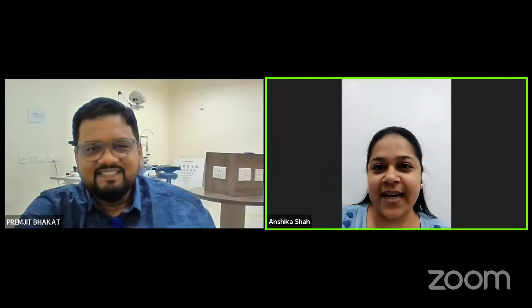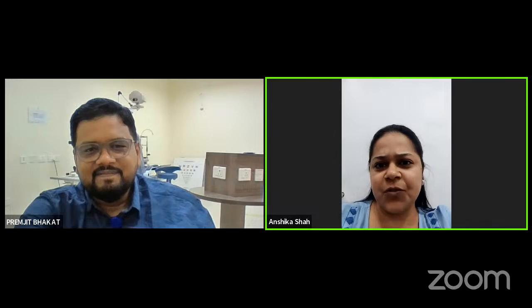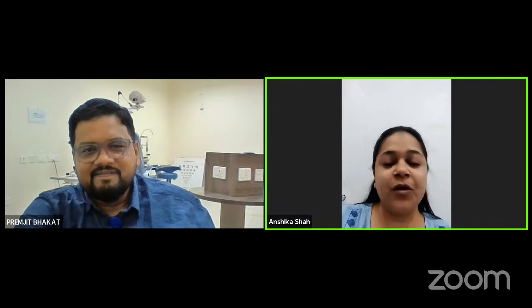Yeah, ma'am. Okay, Meenakshi, thank you, Premjit, for such a detailed explanation. I'll just try to summarize what he's taught us today. First of all, CL is for everyone. We should not stop anyone from wearing contact lenses, or decide who can or cannot wear them. Second, understand the nature of the refractive error for which we want to make them wear contact lenses. And third, decide the type of CL and then look for the fit.